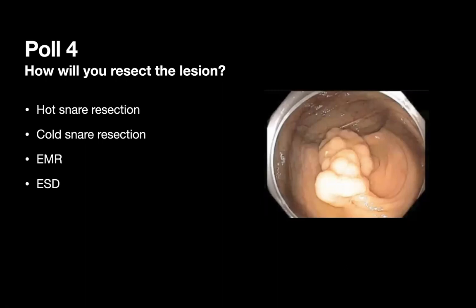Roy, what do you do? I have an easier job here. Everybody has said what they wanted to do, and I just have to put it together. So it depends on the patient. It depends on the staff. It depends on your location.